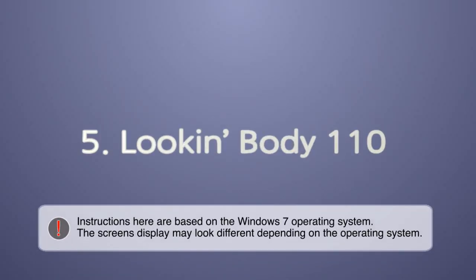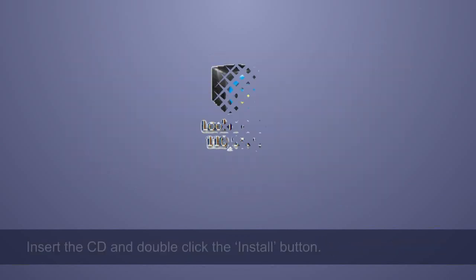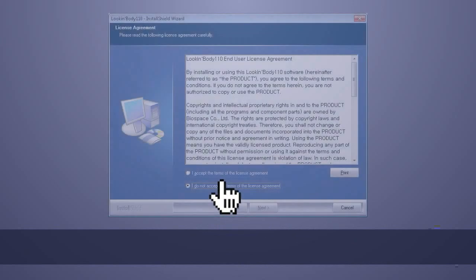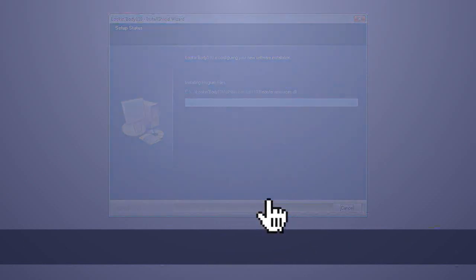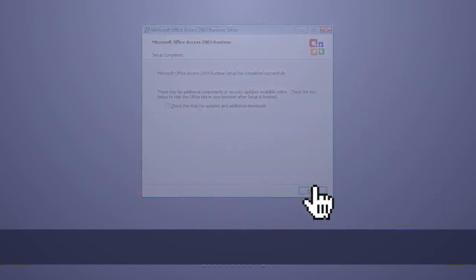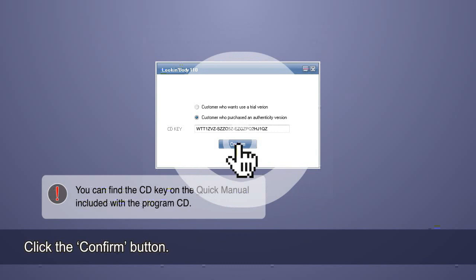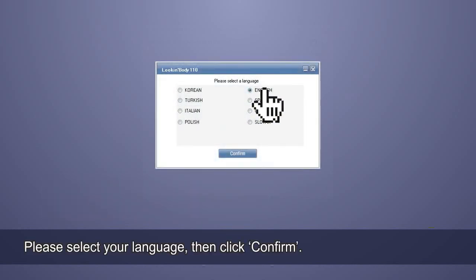Step 5: Look InBody 110. Confirm that you have the Look InBody CD, hardlock key, and serial cable. Insert the CD and double-click the install button. The setup window will show the progress of installation. To continue, click Next. Select 'I accept the license agreement' and then click Next. Click Install to continue — Microsoft Office Access 2003 Runtime will begin installing. Click Finish. Select 'Customer who purchased the authentic version,' enter the CD key, and click Confirm. You can find the CD key on the Quick Manual included with the program CD. Please select your language, then click Confirm.